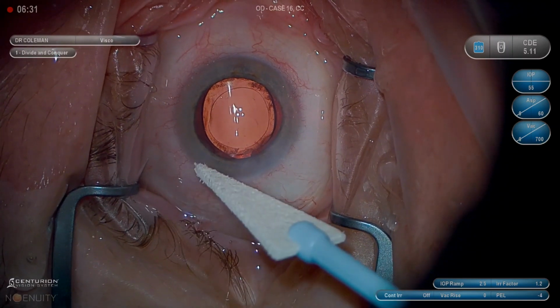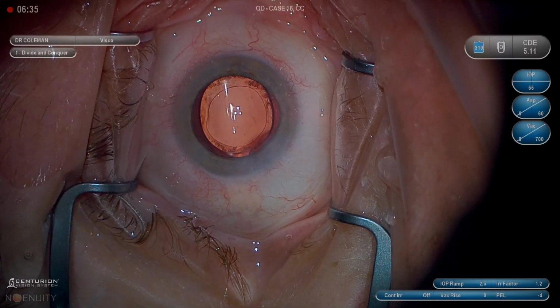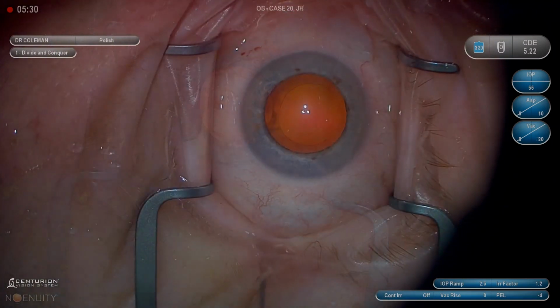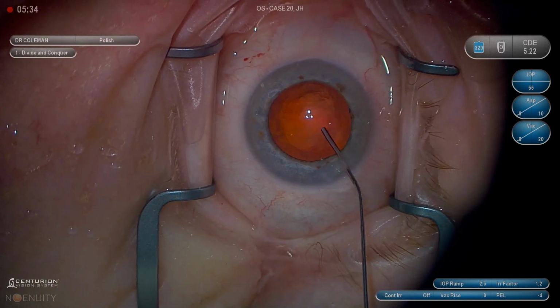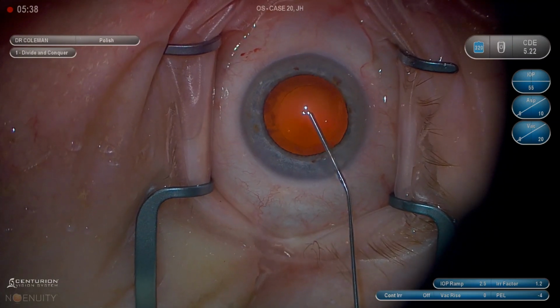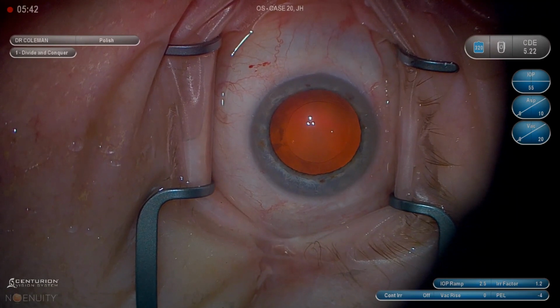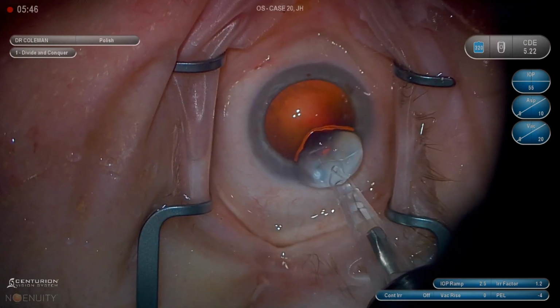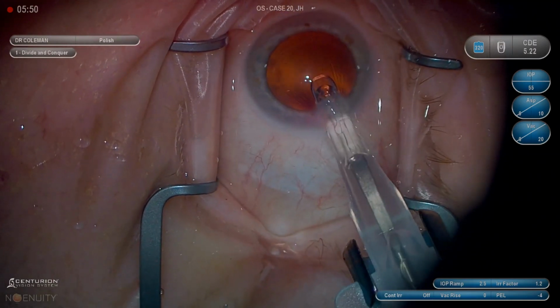I don't know what the official term for it is, but basically what you want to do is lower the pressure in the eye, burp some BSS out of the main wound, and then put some back in without putting the cannula all the way in. Just barely let some flow come back in, and that inner leaflet will flip back the way it should go so it's not rolled back out of the wound, and the wound will suddenly seal. A wound that's been very cantankerous, that if hydrated over and over still leaks, that will suddenly seal it.